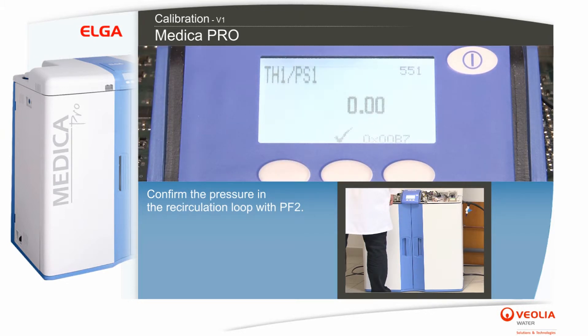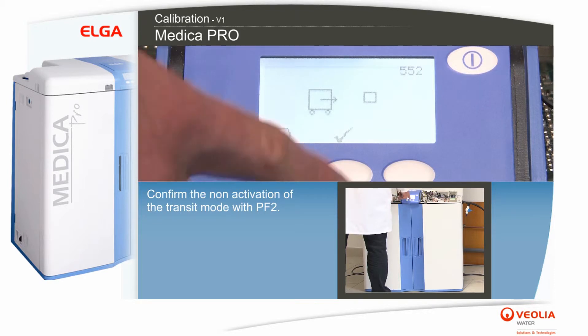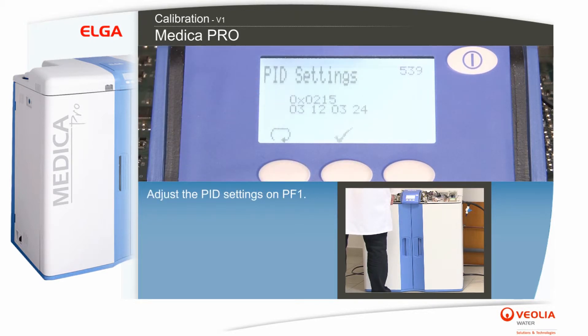Confirm the reservoir level with PF2. Confirm the pressure in the recirculation loop with PF2. Confirm the non-activation of the transit mode with PF2.